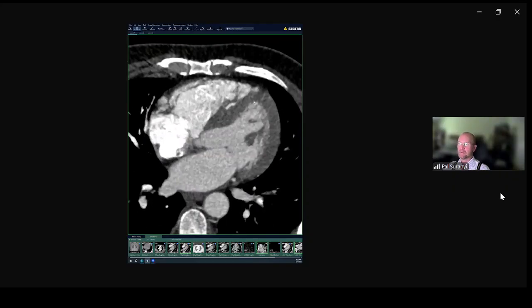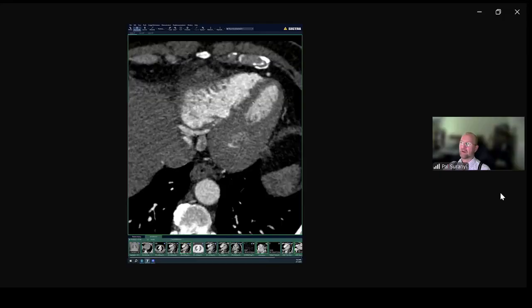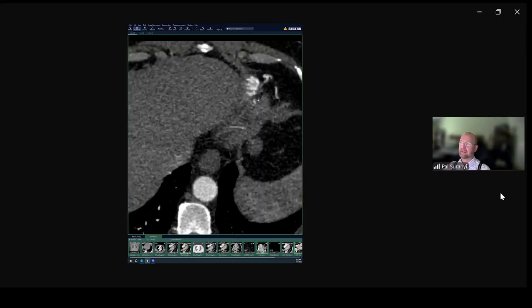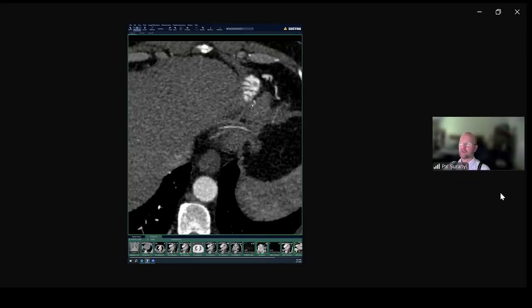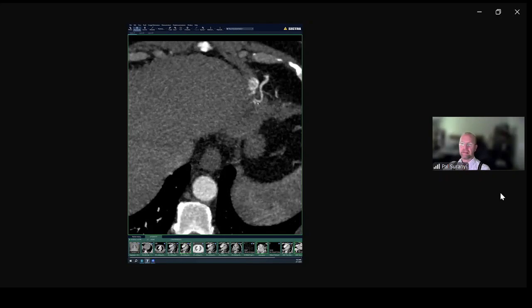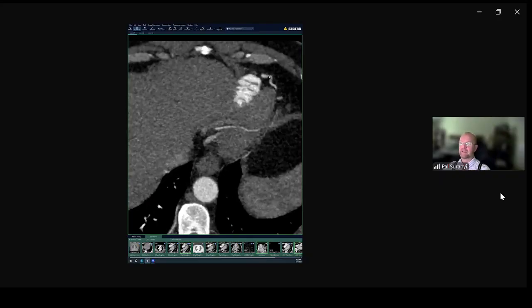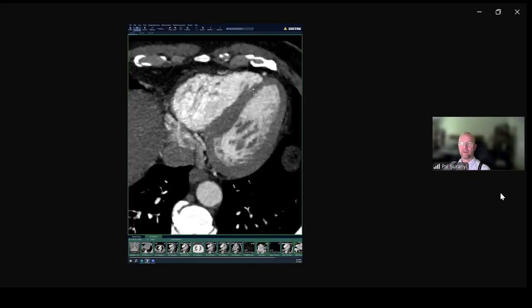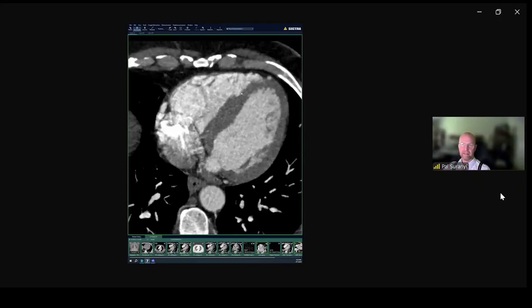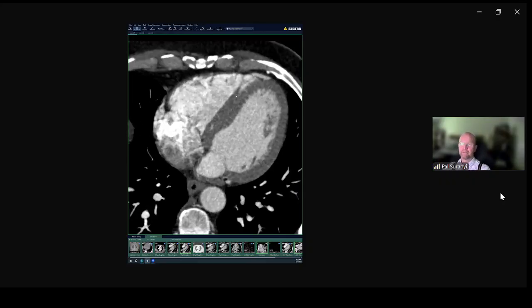Or getting very, very close. So one of the things that happens with anomalous coronary arteries from the pulmonary artery is that they develop what are called coronary sinusoids, at least around here, that's what we call them, where these vessels are stealing blood from the ventricular chambers and then end up with retrograde flow into the pulmonary artery because the pulmonary resistance is going to be lower than the resistance in the normal coronary bed, in the normal coronary network.